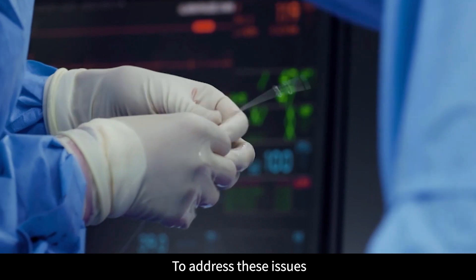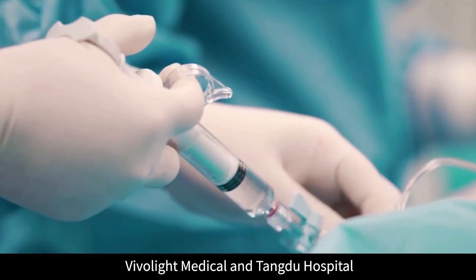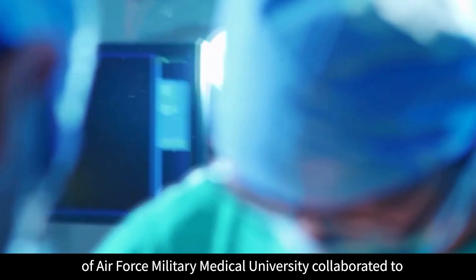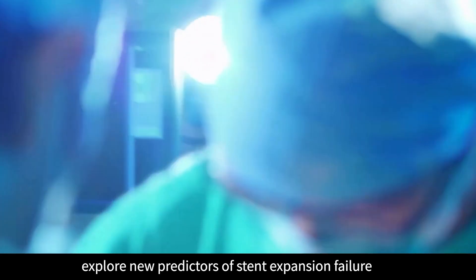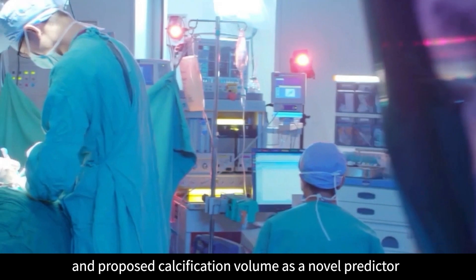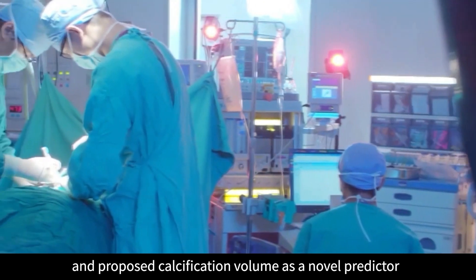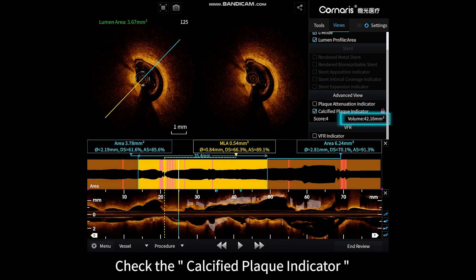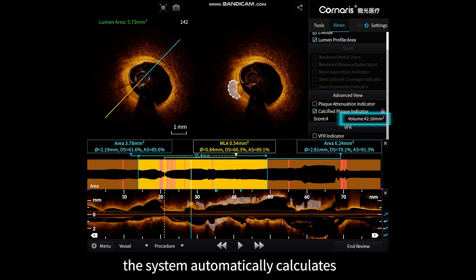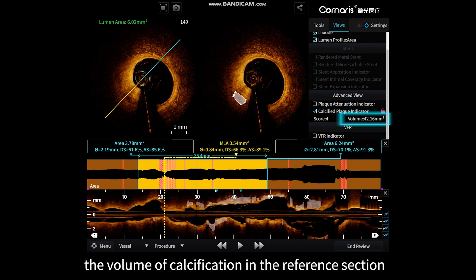To address these issues, DivaLight Medical and Tangdu Hospital of Air Force Military Medical University collaborated to explore new predictors of stent expansion failure and proposed calcification volume as a novel predictor. Check the calcified plaque indicator — the system automatically calculates the volume of calcification in the reference section.